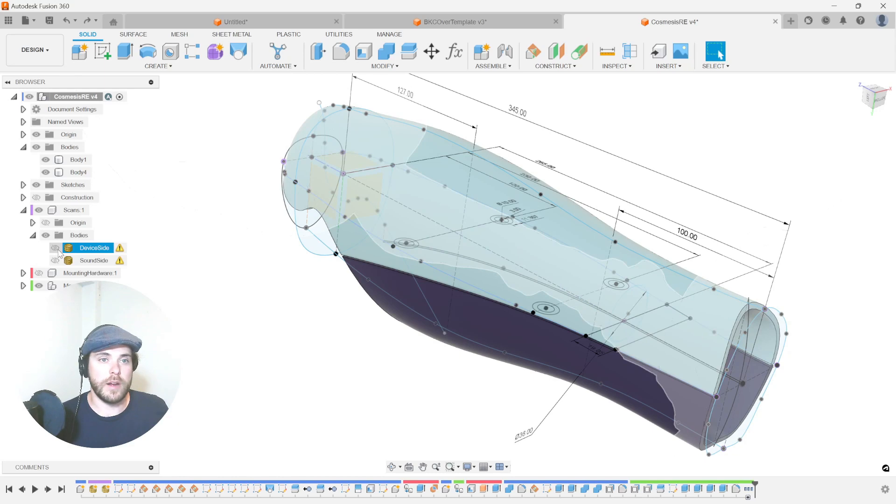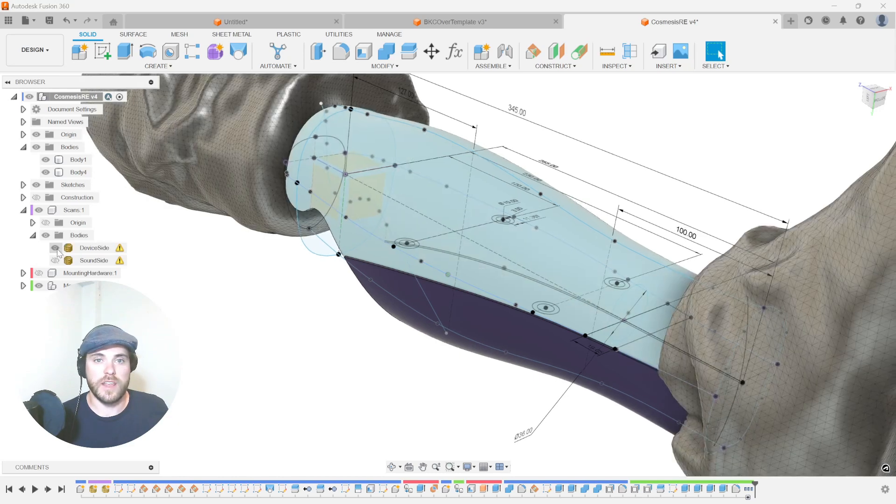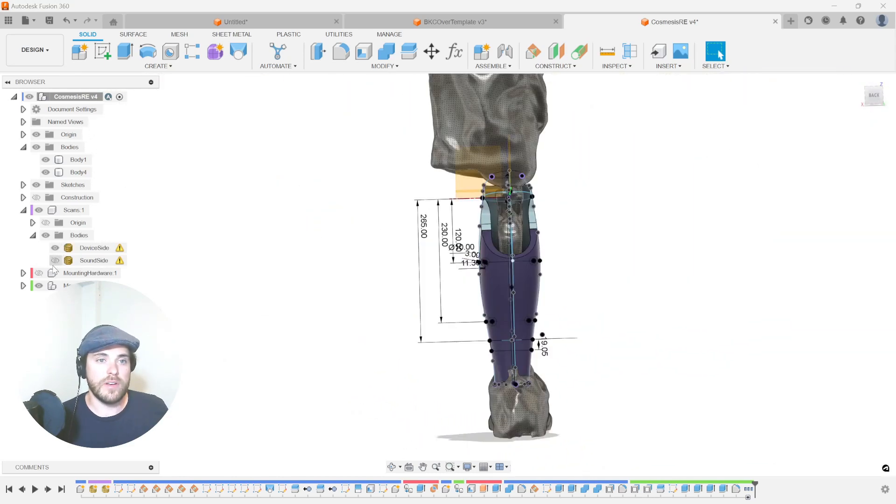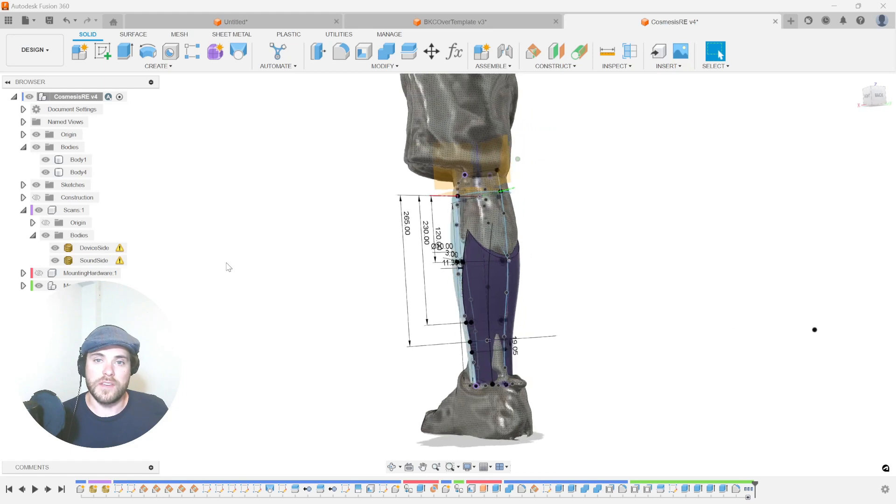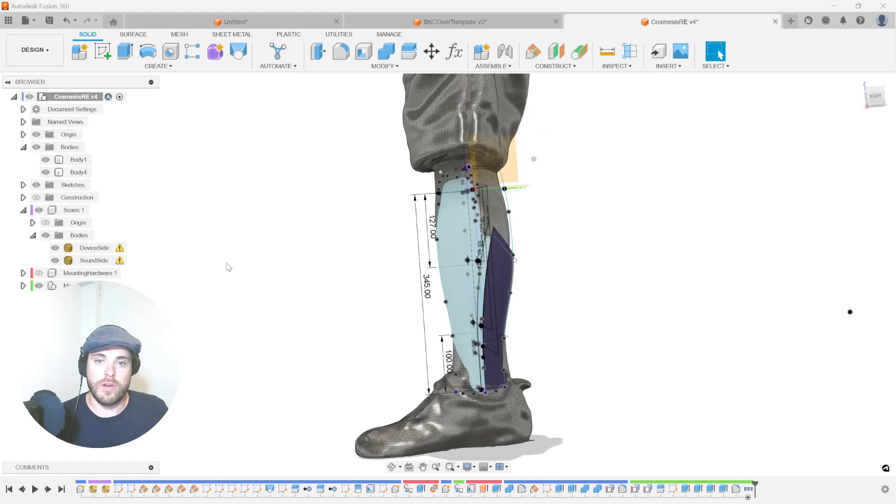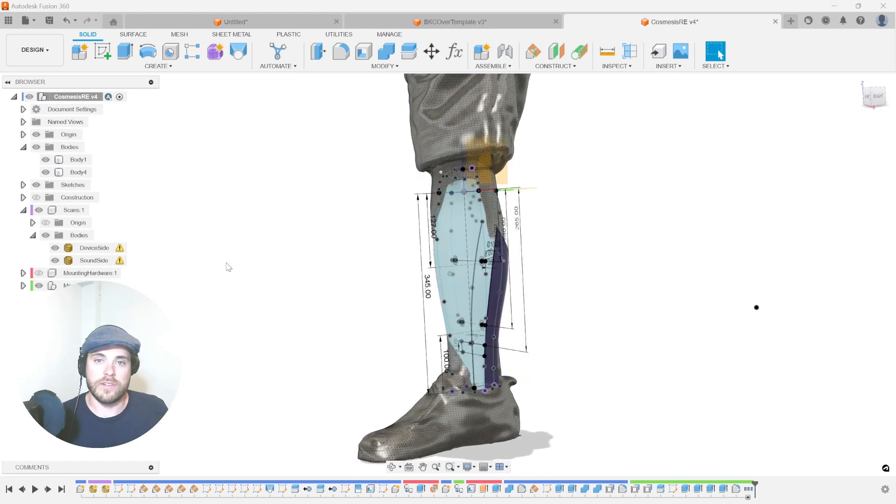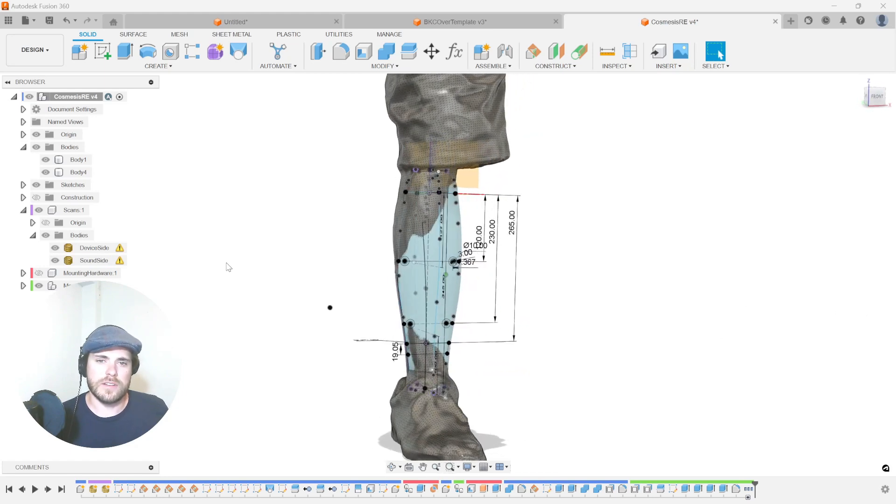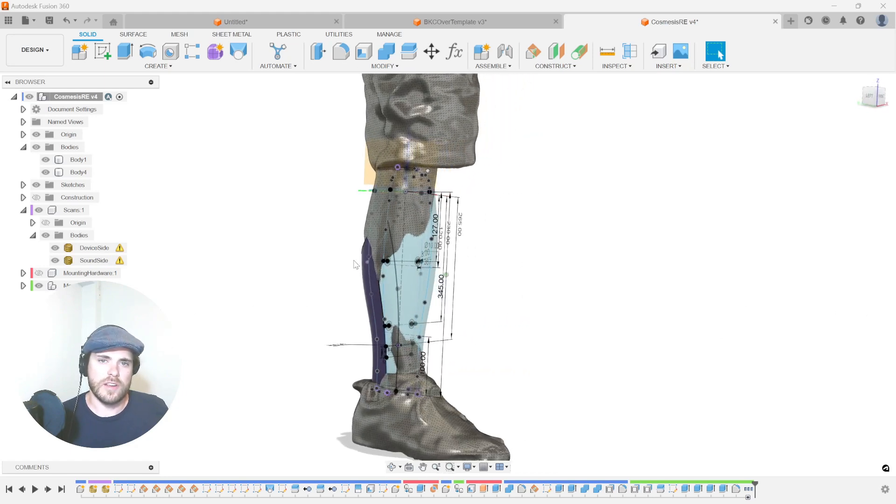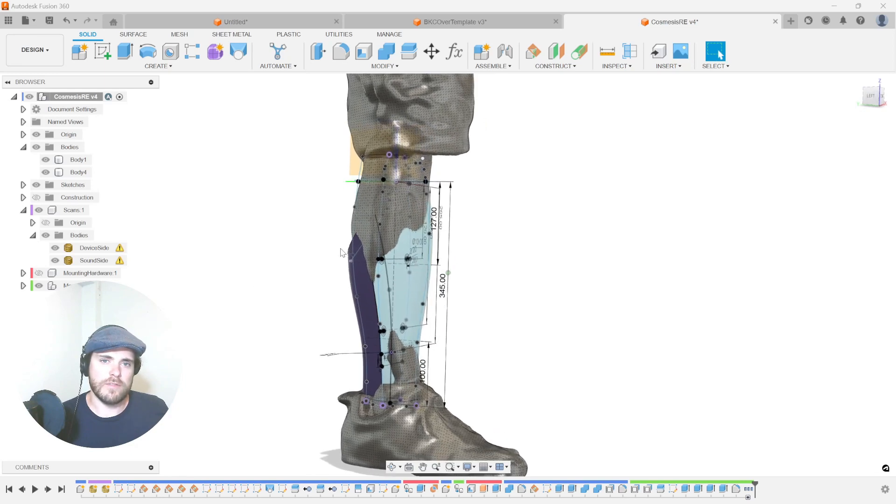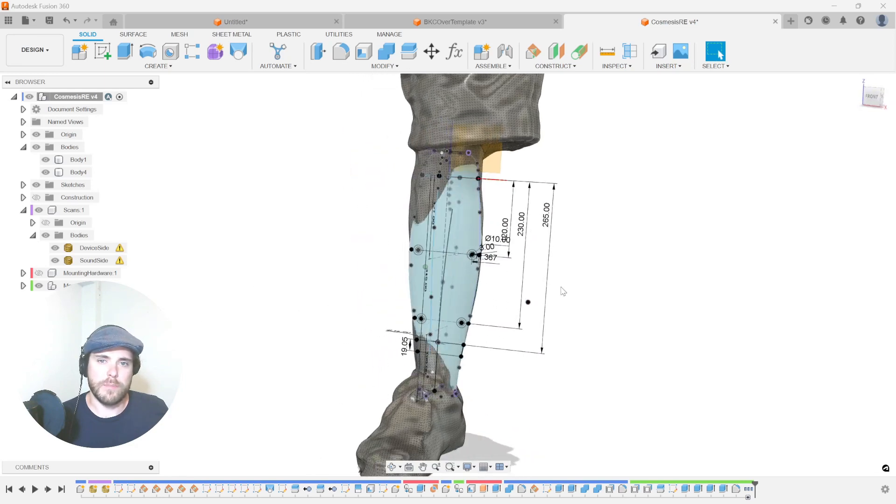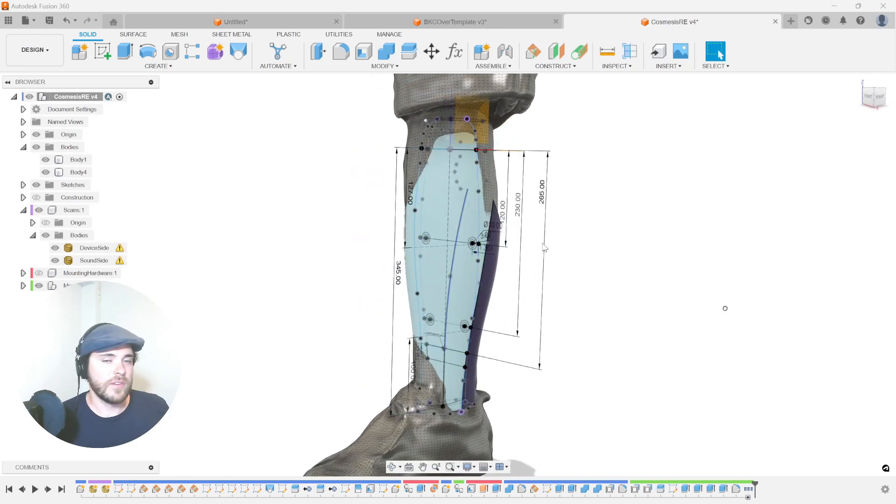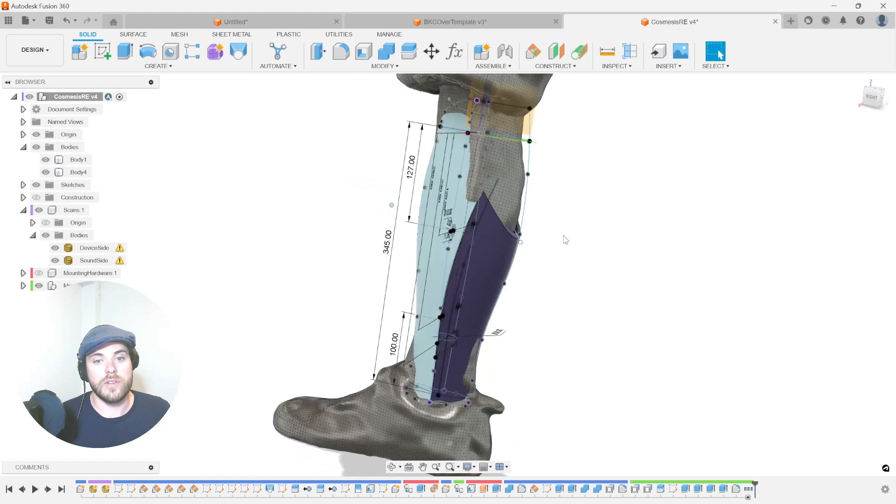So what does that look like? Let's bring in our prepared 3D device scan from the training. And then we also mirrored the sound side of the exact same scan and brought it in on top of our template. All we need to do now is change the shaping of this and update the mounting hardware so it all matches.